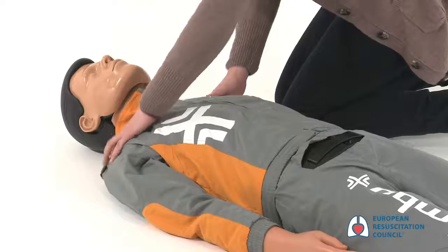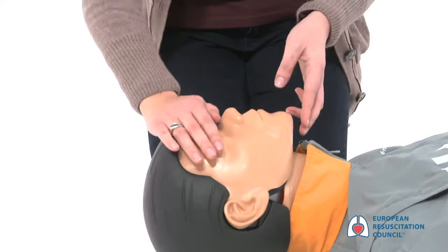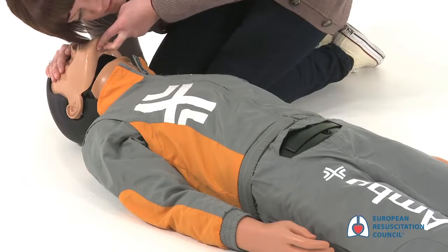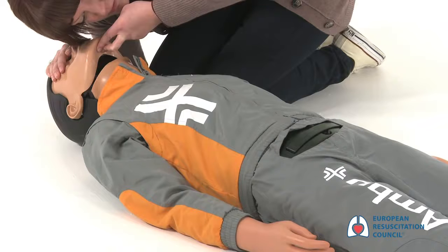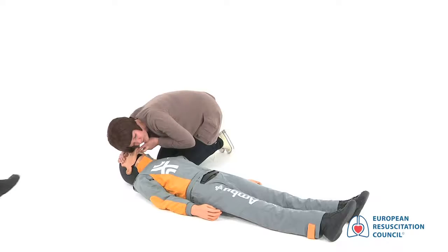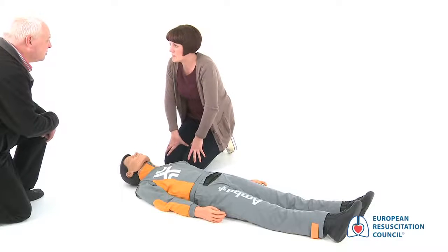Are you all right? Help! Can somebody help me, please? How can I help you? Call for an ambulance and bring me an AED.